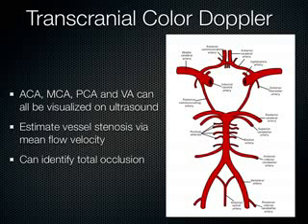And there's been a lot of work looking at patients who are having a stroke, not only identifying which vessel is affected with ultrasound, but also potentiating the effects of a clot-busting drug like TPA. You can use smaller doses of TPA because it has a lot of side effects, and then when the TPA arrives at the location of the clot, you can activate or potentiate its effects using ultrasound to help increase the surface area of the clot for the TPA to work on. Anyways, a lot of cool stuff going on here.